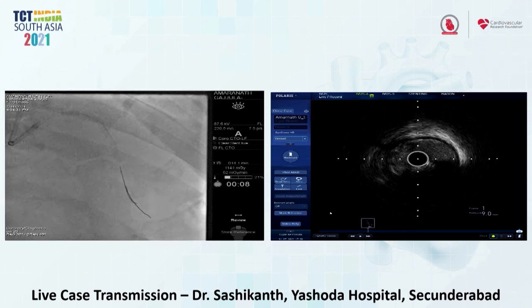One more thing: what was the advantage of keeping it there anyway? Once you have positioned the stent, you could have taken it out and inflated, or no? The stent moves sometimes when you're doing the push-pull technique. The stent moves sometimes and misses the ostium. Well, this is the reason why we retain the IVUS.